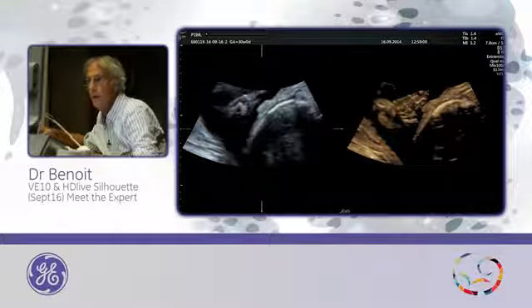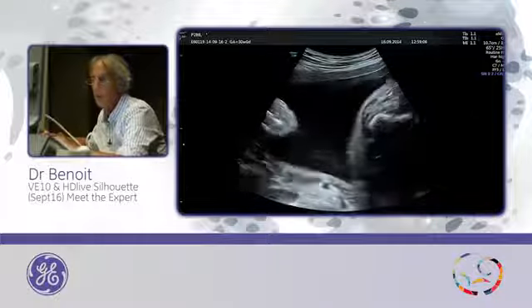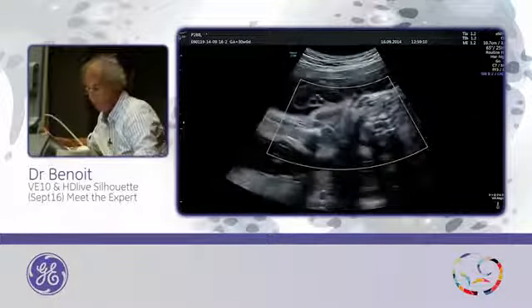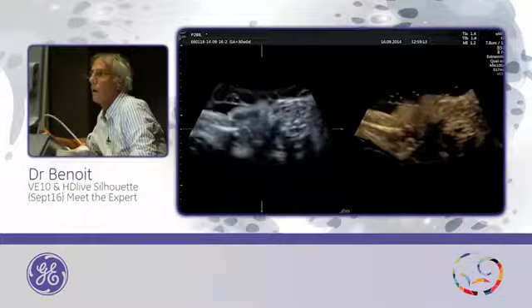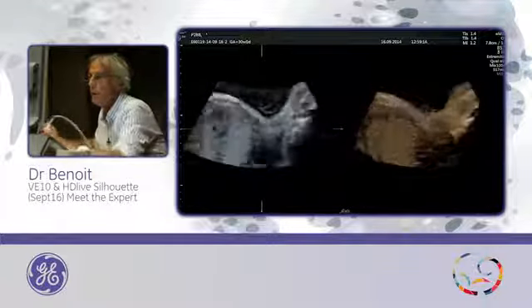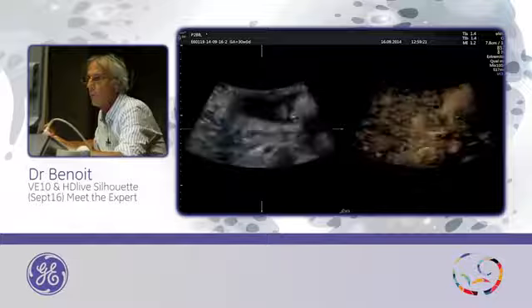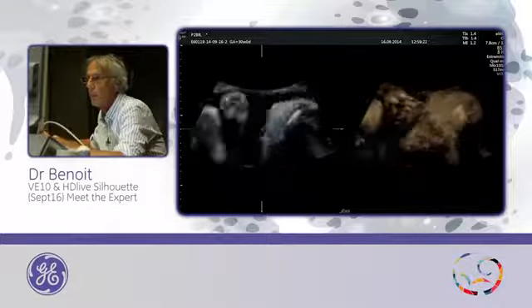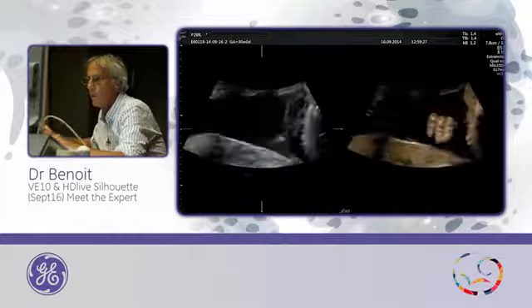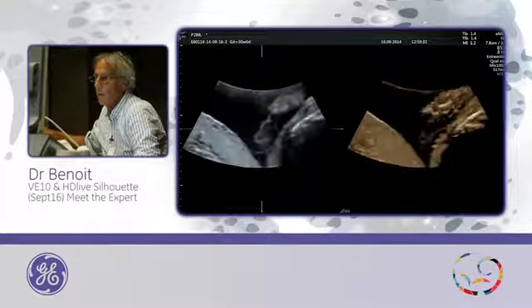You can see here, and you cannot see it on 2D, only because in this case we use a thickness of 17 millimeter, and the frame rate is 8 frames per second. So all the fingers.